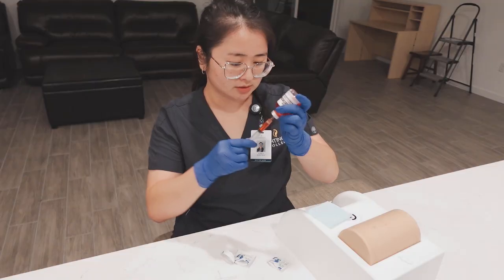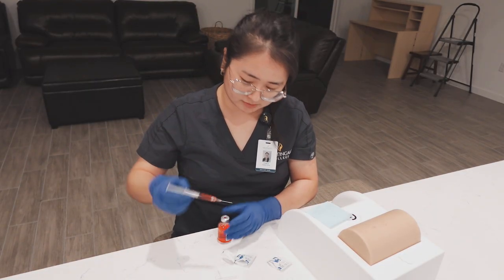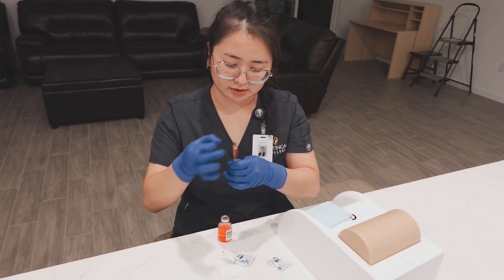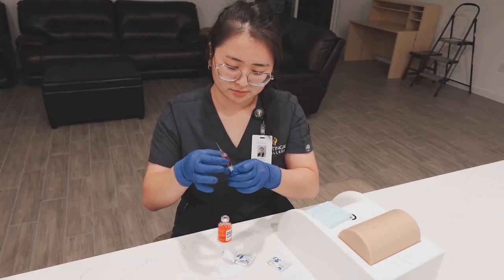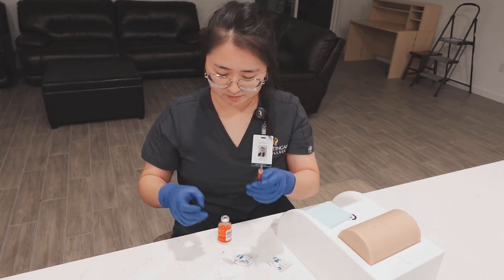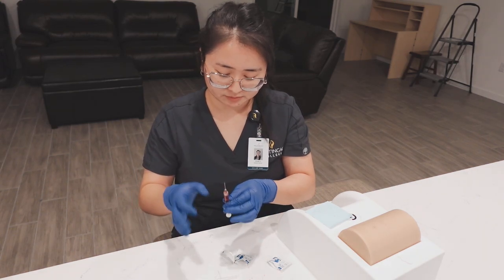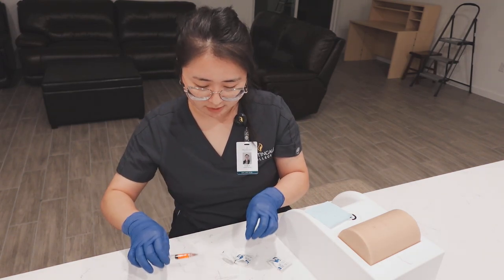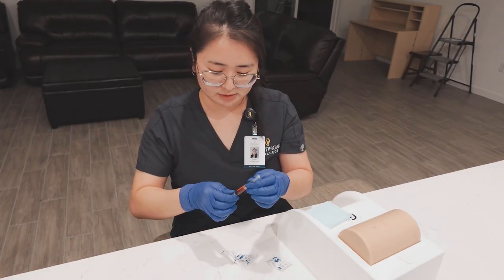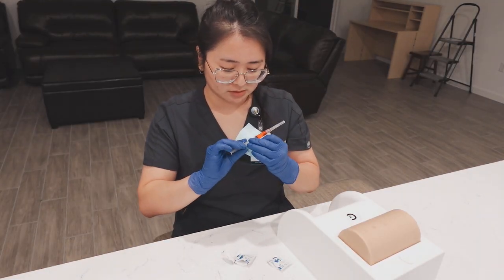All right, this is actually appropriate. Make sure one more time. Yep. All right. So one more time, I'm going to flick the medication, making sure that there are no air bubbles. Yep, no air bubbles. Okay, and I'm going to move this to the side. No air bubbles, so I am now going to use the swoop method, put on the cap. All right, now I'm going to show it to you. Okay, it's right here.